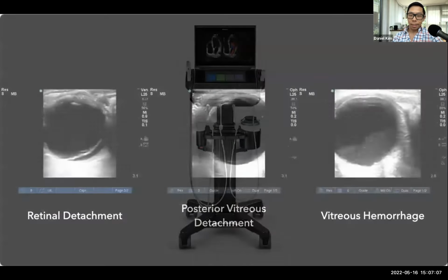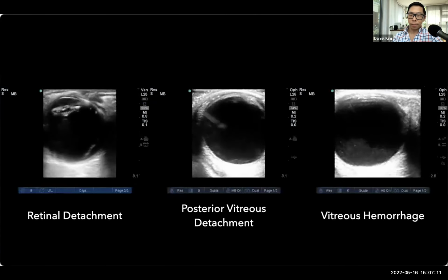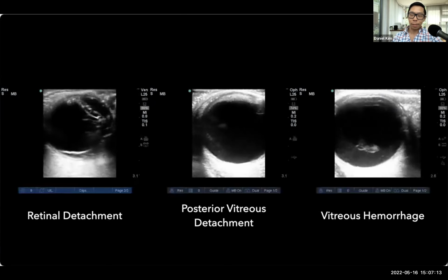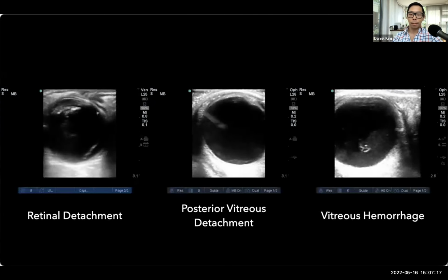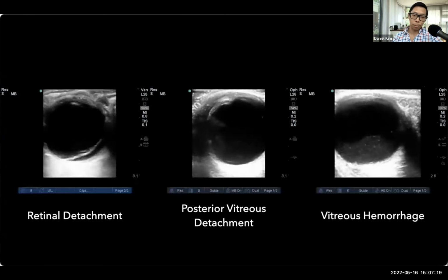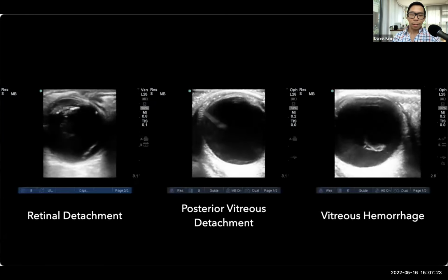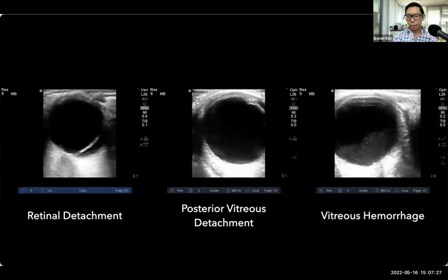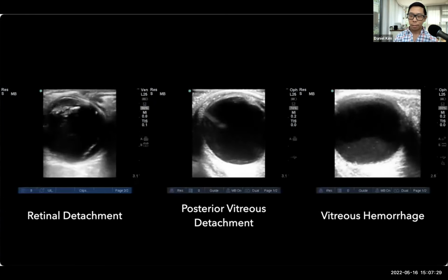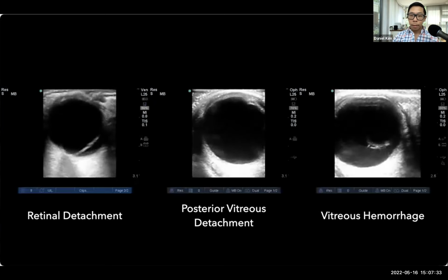Ultrasound is way more intuitive for diagnosing posterior chamber pathology, right? You toss the probe on and you can actually see. With retinal detachment, expect to see a hyperechoic thick membrane with minimal after movement. Posterior vitreous detachment has a much thinner, less prominent membrane that has more after movement, and vitreous hemorrhage is going to give you a sonographic appearance of hyperechoic material swirling around in the posterior chamber.